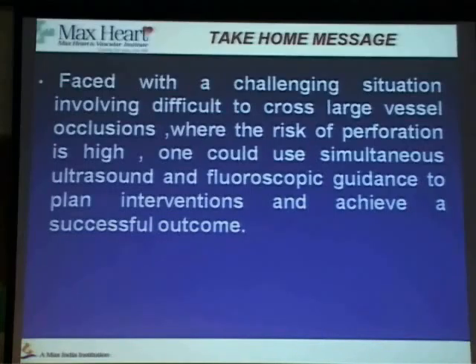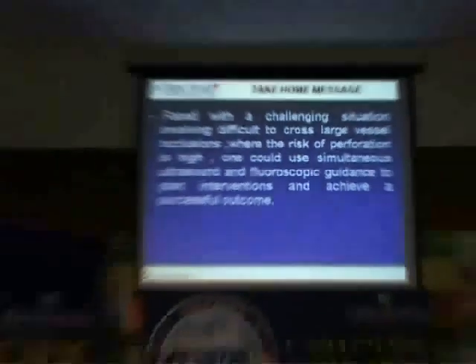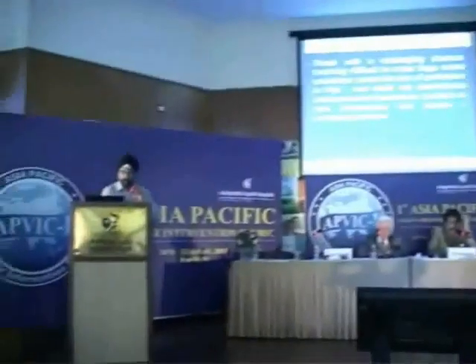Just the final slide, the take-home message. When faced with a challenging situation involving difficult-to-cross large vessel IVC occlusions where the risk of perforation is high, one could use simultaneous ultrasound and fluoroscopic guidance to plan interventions and then achieve a successful outcome. Thank you.